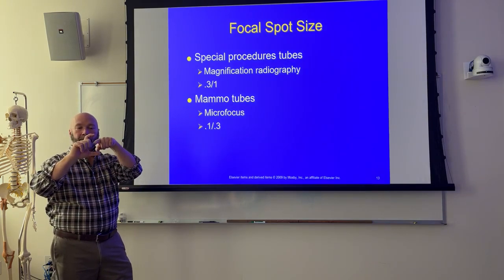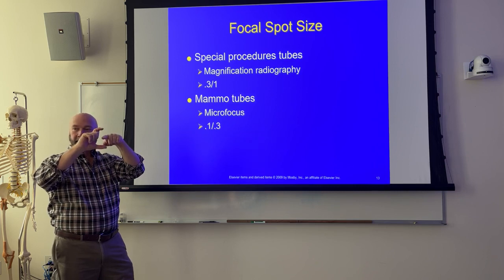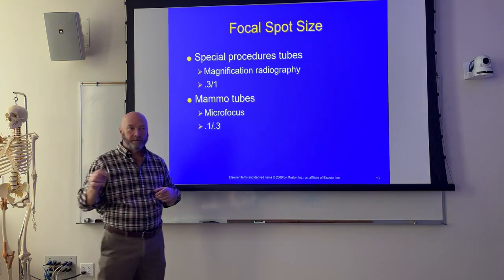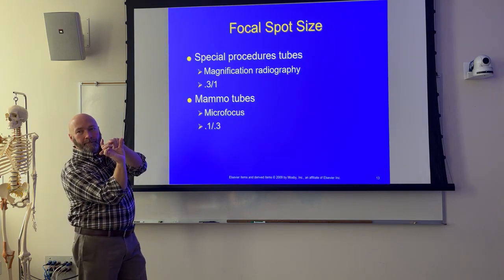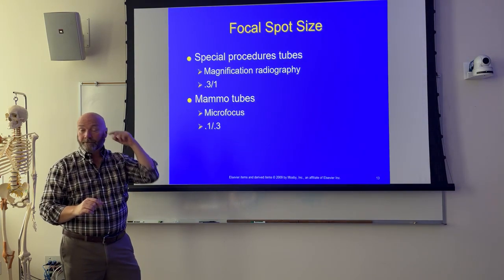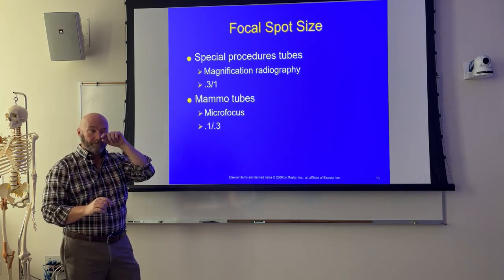But if you put the patient dead square in the middle of that C, and the doctor's injecting some contrast and they're looking for a small tumor inside the patient's head, and they need to see it in a lateral, do you really want to have to adjust your height and then go from AP to a lateral, or do you just want to swing the C-arm up into a lateral? It's quicker just to swing the C-arm up, right?